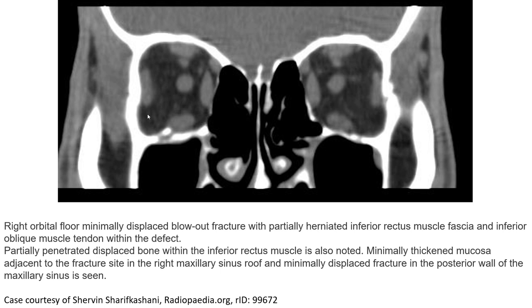There is minimal mucosal thickening adjacent to the fracture site in the right maxillary sinus floor, and a minimally displaced fracture in the posterior wall of the maxillary sinus is also seen.